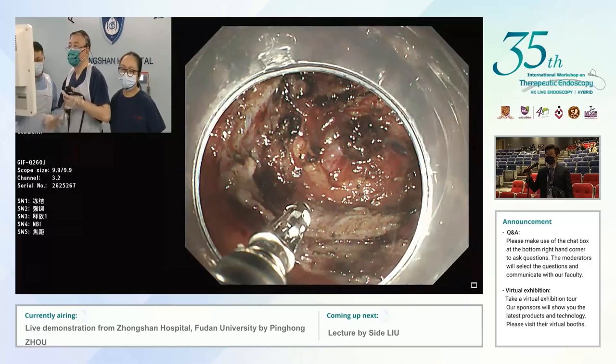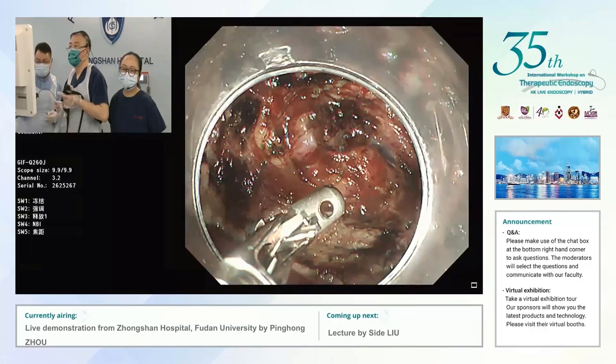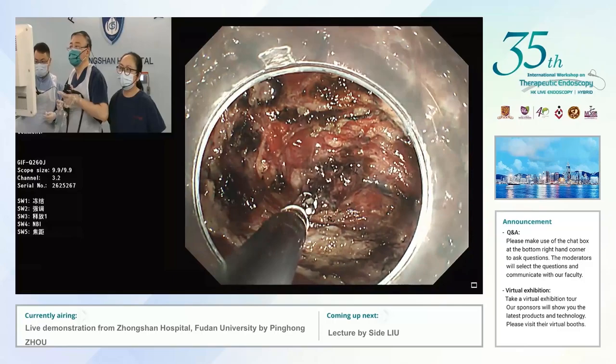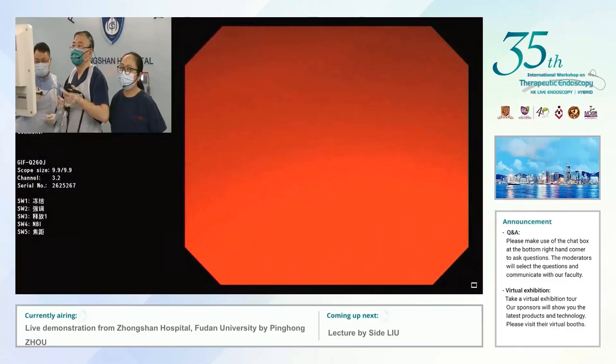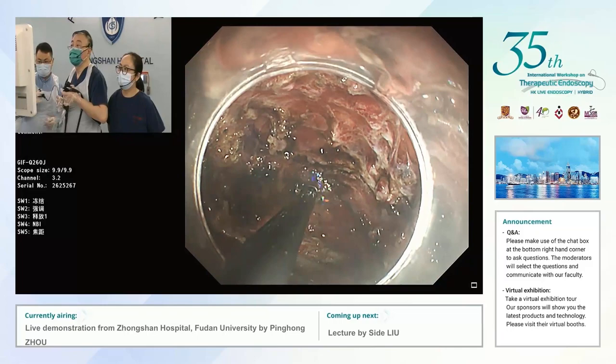Here is a bigger vessel. We agree with your comments, Philip. But the over-stitch is not available in mainland China — we are struggling with equipment coming into mainland China. So the mainstay of our closure technique now is string suture with the end loop and the clips. Here is a bigger vessel from the greater omentum.